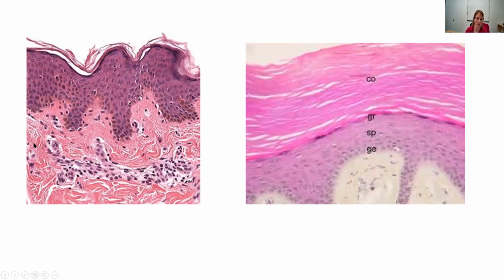All right, these two are also the same thing. So this is connective tissue down here. But I want to know this stuff here and this stuff here. And look, I can see an edge and I can see an edge. So I'm talking about the epithelium. You can ignore these letters on here. I just copied and pasted this off of a website.